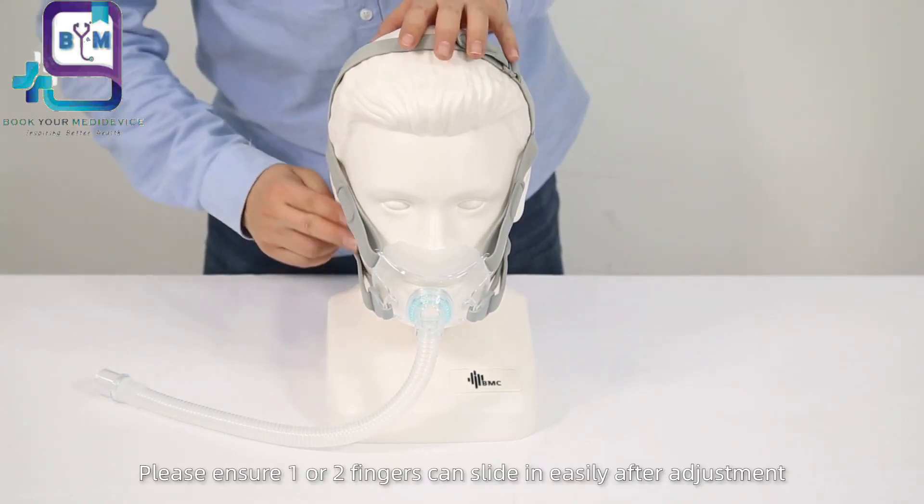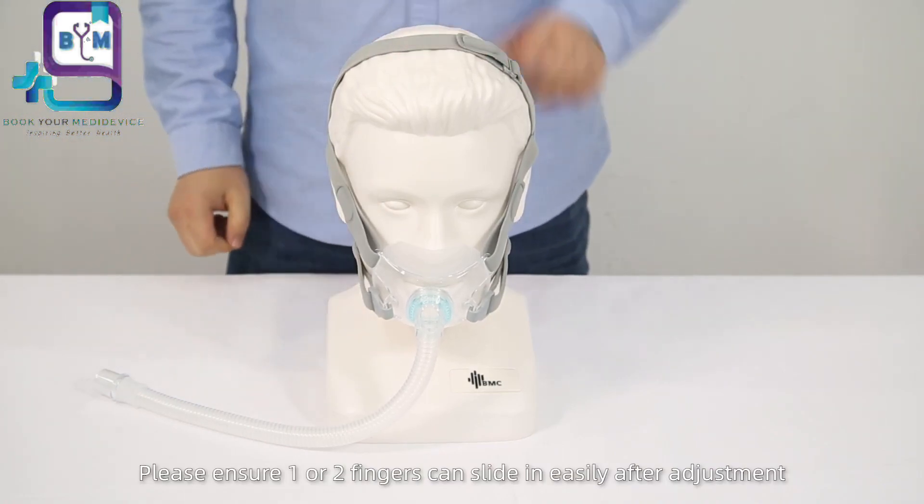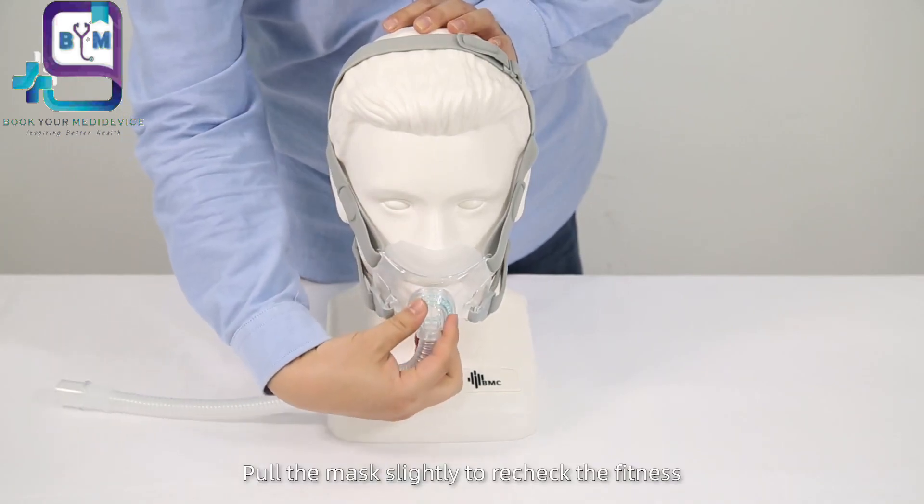Please ensure one or two fingers can slide in easily after adjustment. Pull the mask slightly to recheck the fitness.